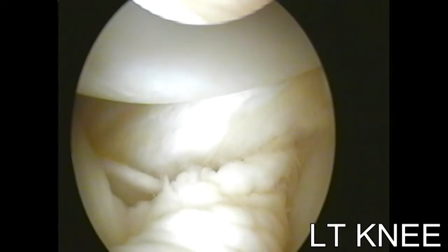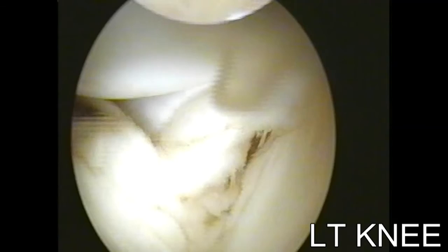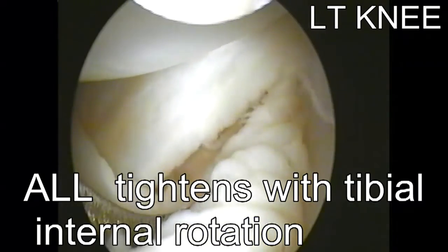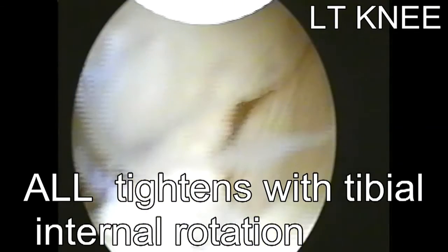Through the standard anteromedial portal, the proximal part of the ALL can be assessed. ALL tightens with tibial internal rotation. Pushing the ALL laterally will reveal the lateral collateral ligament.